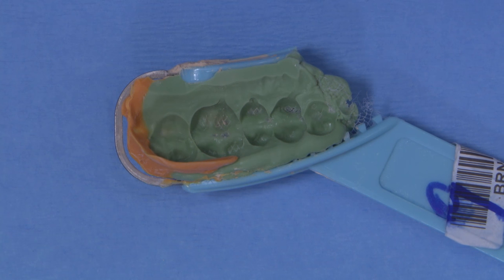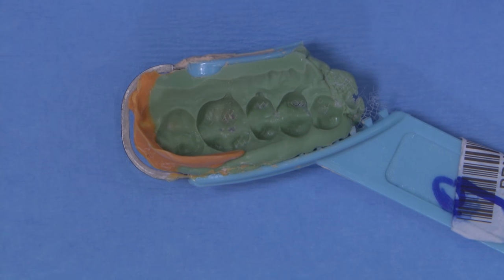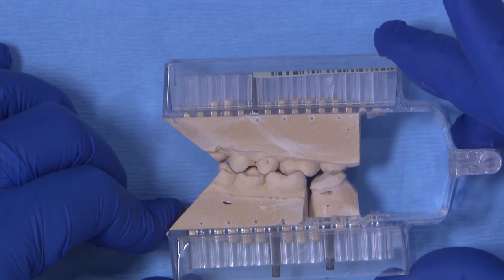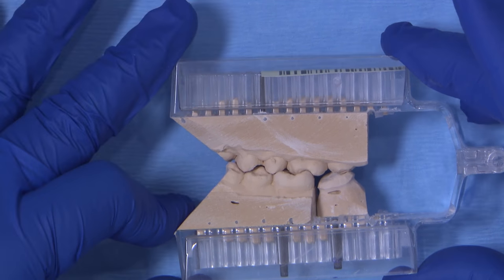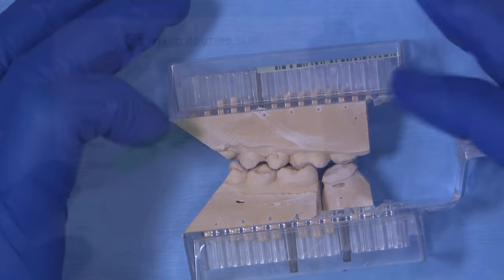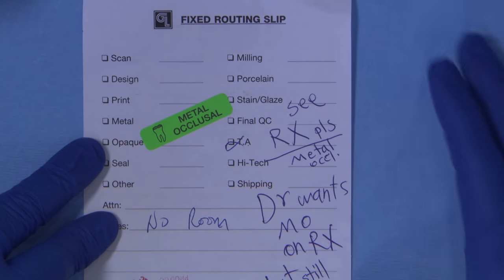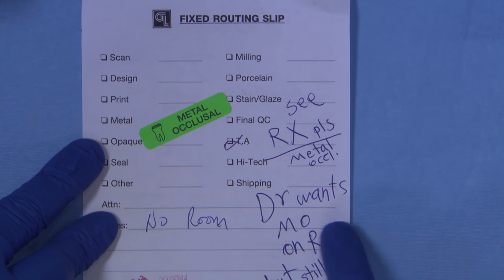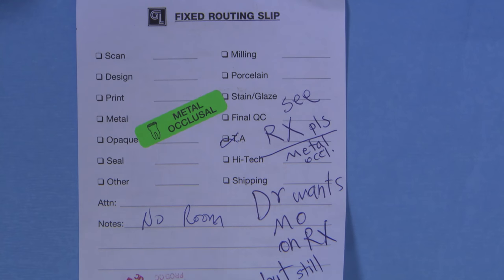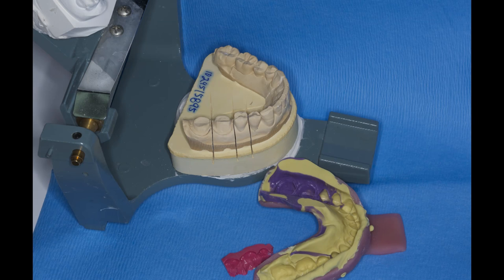We can minimize this problem by using full arch impression trays and a separate bite registration taken only over the prepared teeth. A plastic articulator also flexes and bends if there is no terminal stop, altering the occlusal clearance. Usually, the doctor gets a call from the lab to ask for permission to adjust the opposing. This will result in restorations being fabricated with a faulty occlusal contact. To avoid this, the full arch casts can be mounted using the occlusal bite registration, utilizing a metal articulator to stabilize the interocclusal space.